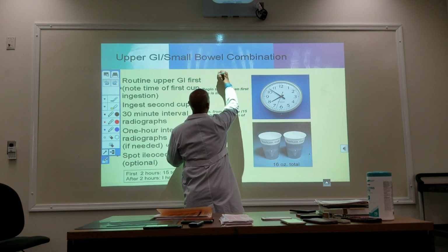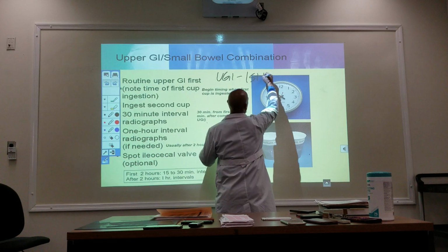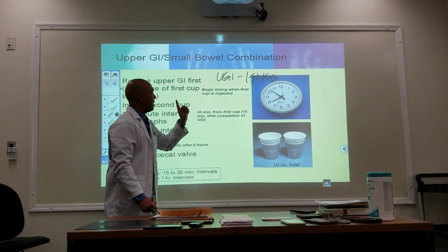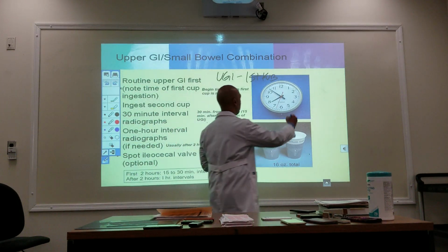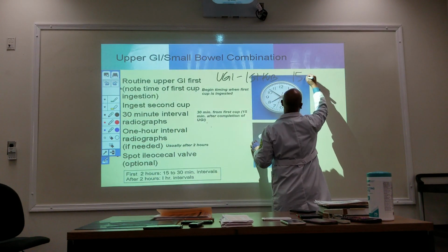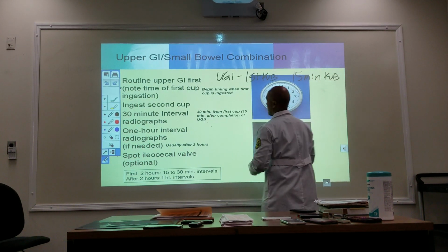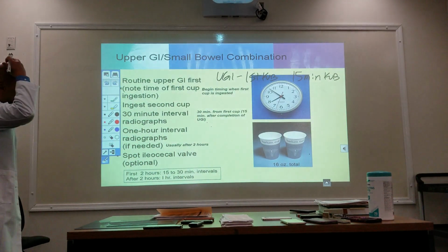So during the upper GI, your first KUB that you took, okay, we're going to call that 15 minutes. This is going to be your 15-minute KUB. A PA KUB. Prone, okay?